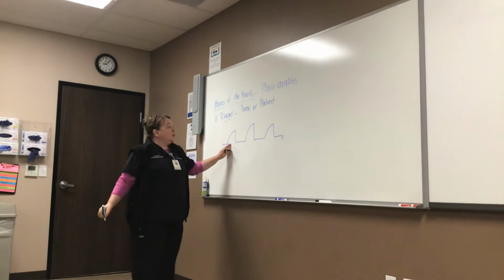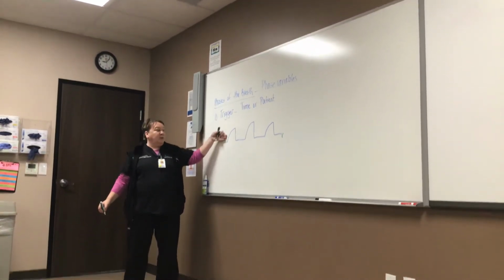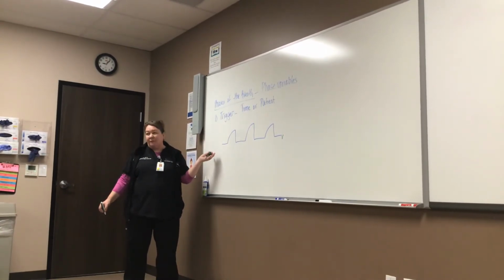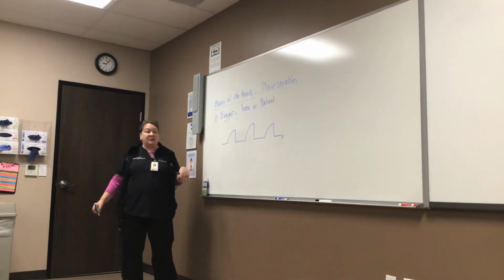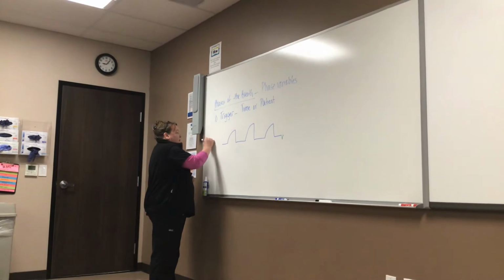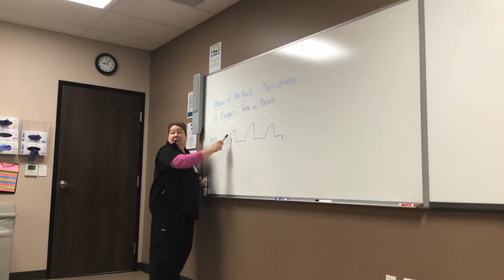Okay, so we know by looking at this is a waveform, and you guys are going to see me draw these as we go forward, so they'll start to look familiar, but you won't really know what the waveform is until later on in the term, but that's okay. So I will tell you that this is the pressure. This marker's going to work. So we know it's a ventilator-delivered breath when it's all positive, okay? So as soon as the breath is delivered, it's going all positive.